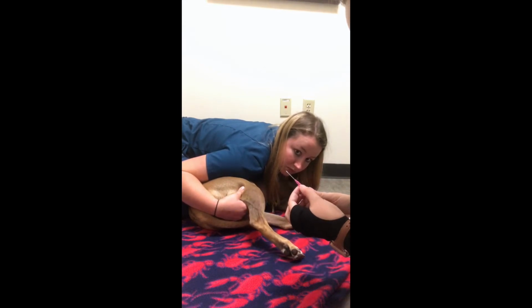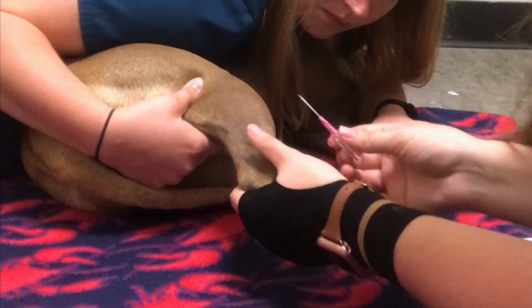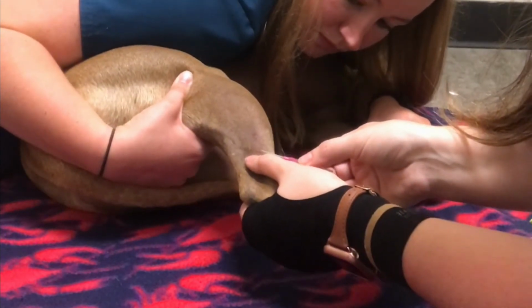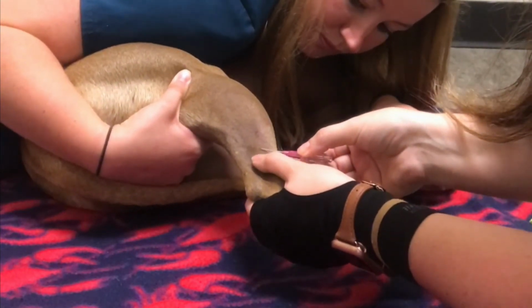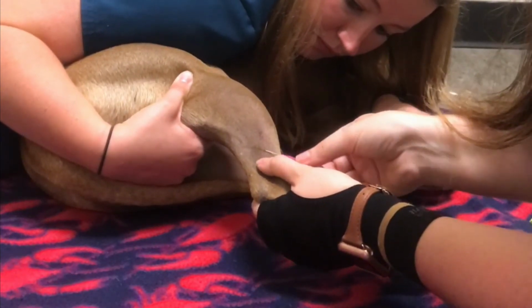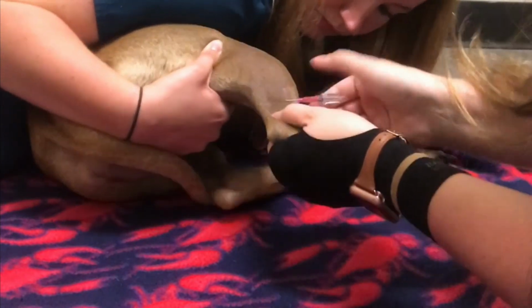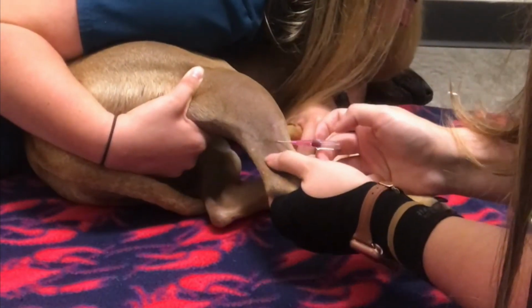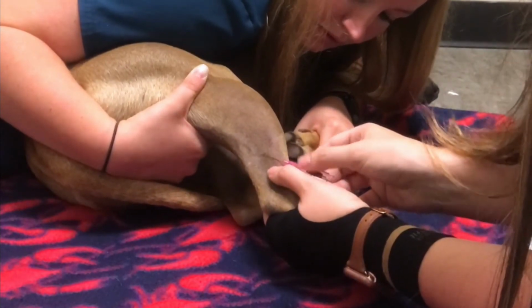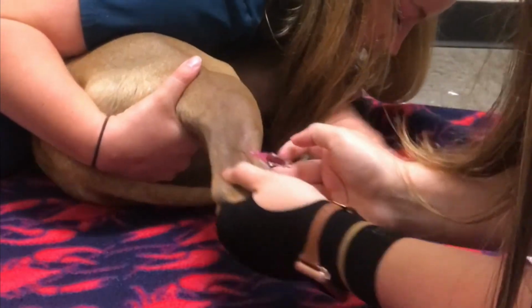I'm going to prep the catheter with the bevel up. We're going to insert. Okay, we're in. And we have a flash. It's okay. It's okay. Stay.